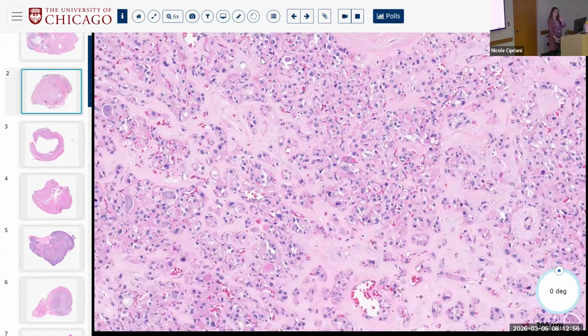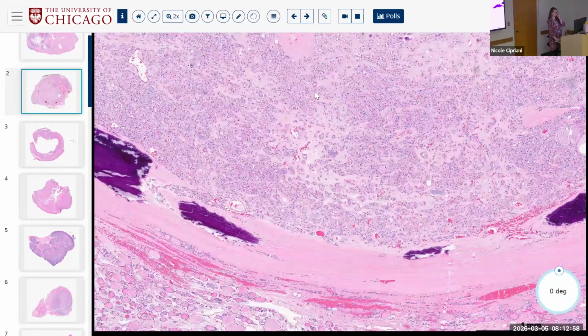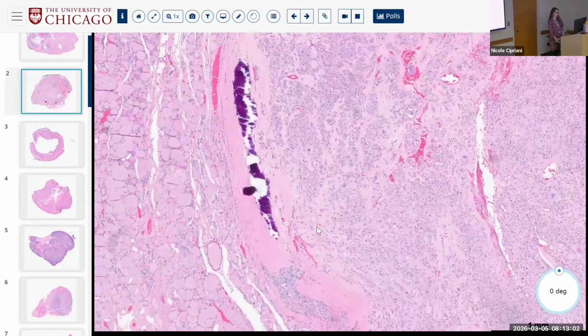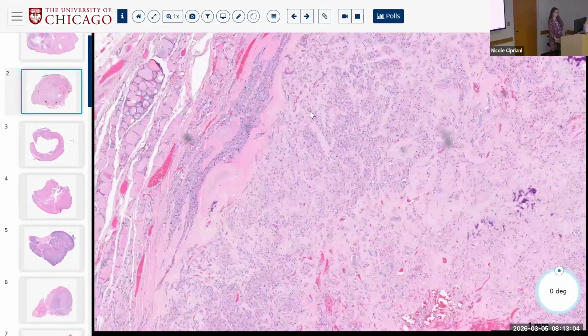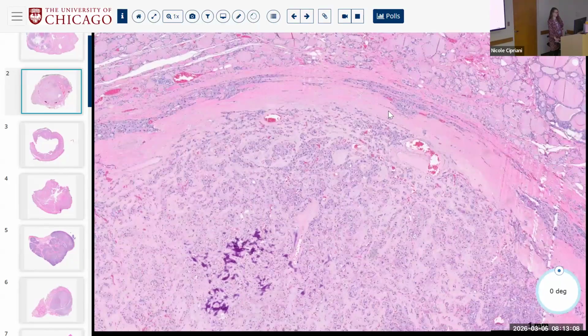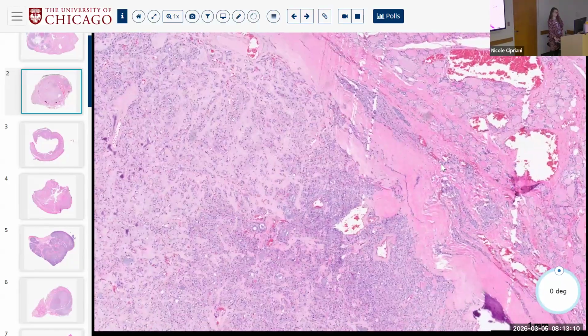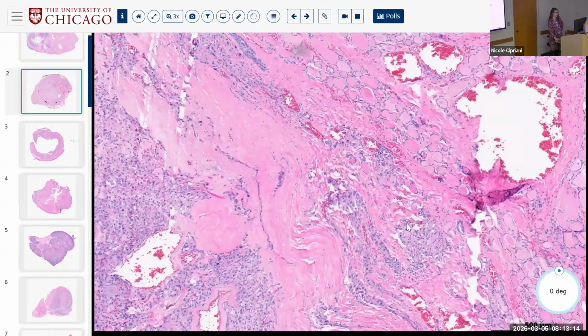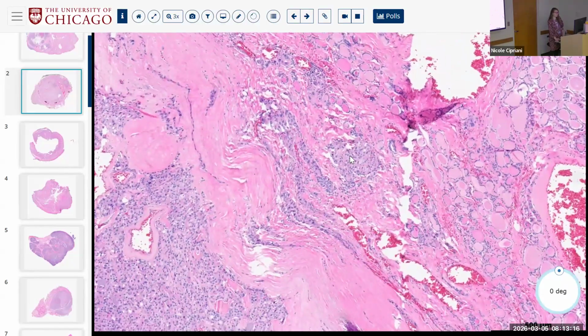All right. But knowing that the diagnostic criteria are the same, does anybody think this tumor is benign or malignant after having looked at it? Or hopefully if you've previewed it. If not, I'm going to drive around the edge. Mostly malignant, like on the edge. Yeah, they're kind of surrounding nerves in some places too.